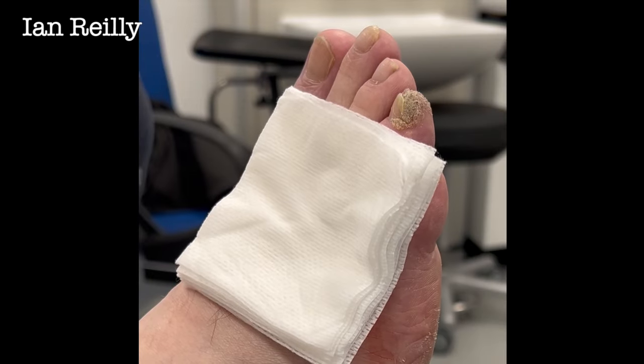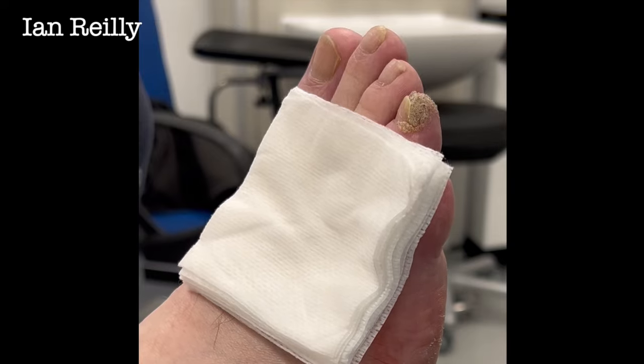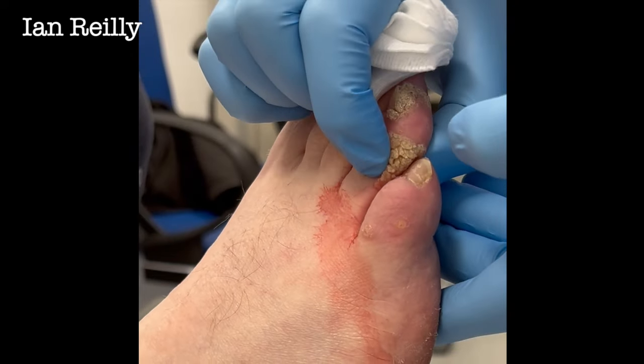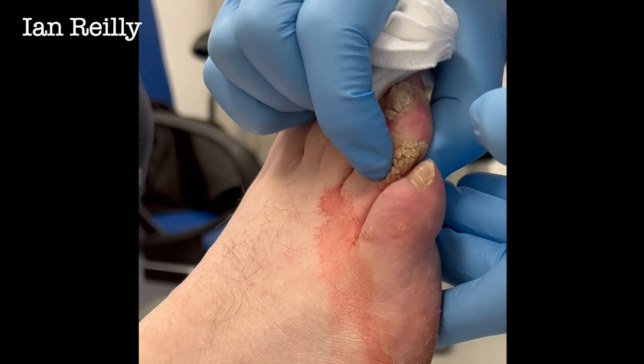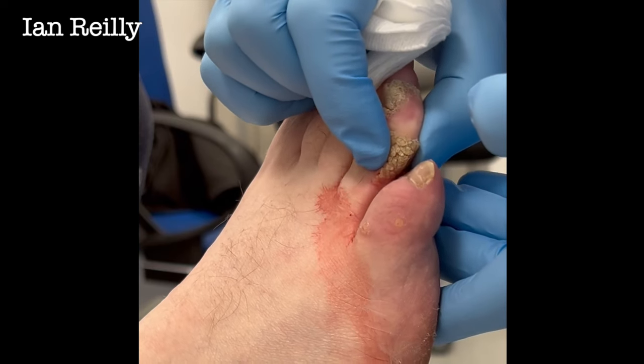Kevin, we're going to just see if you're nice and numb after we've done that little bit of local anaesthetic. There's a tiny bit of claret there. If I have a sharper blunt there — that feels as I'm just pressing. I can feel where the callousy bit is.